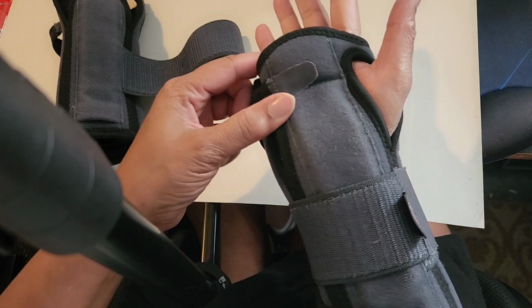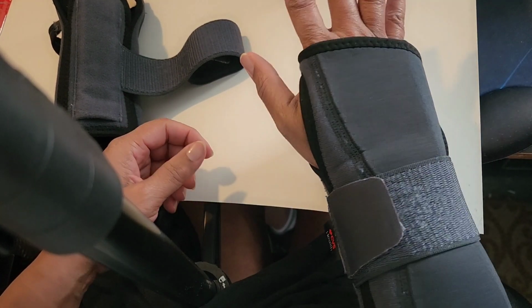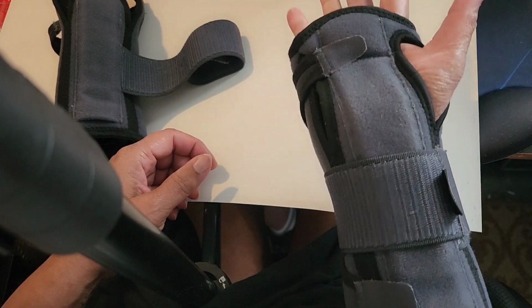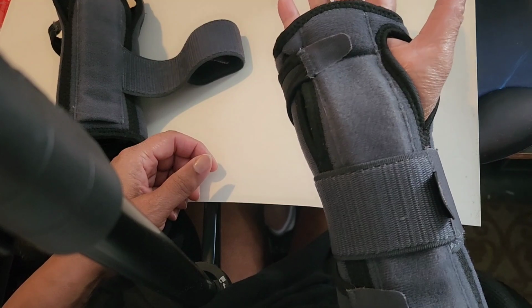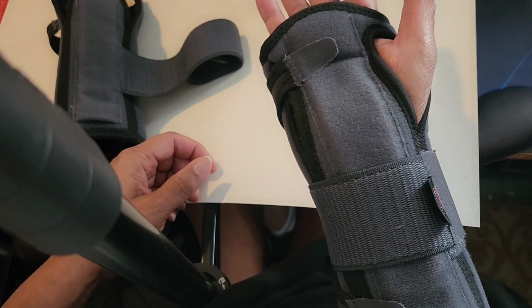So your doctor may recommend this. There's a lot of them online. I know Mueller is supposed to be a really good, popular one. I just went to CVS and got their brand, but this is pretty good. I've got to get used to using it, but I just wanted to show you this is one way that my doctor's telling me to do to avoid carpal tunnel getting worse.